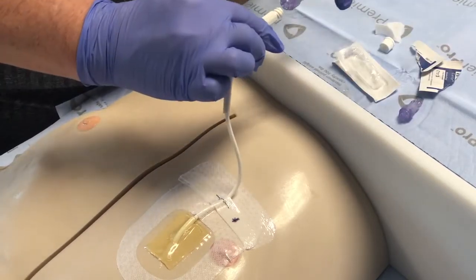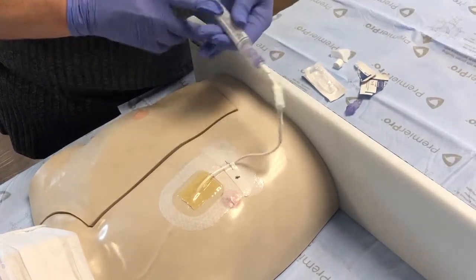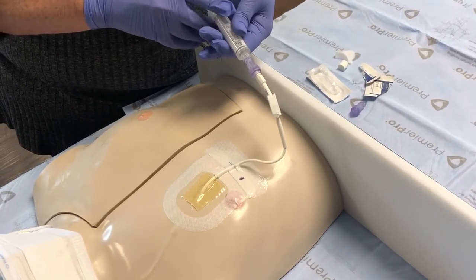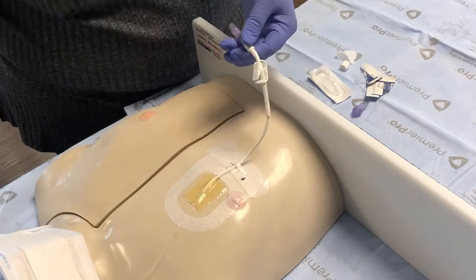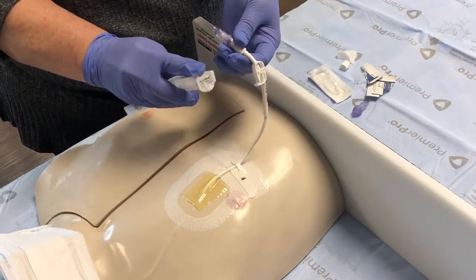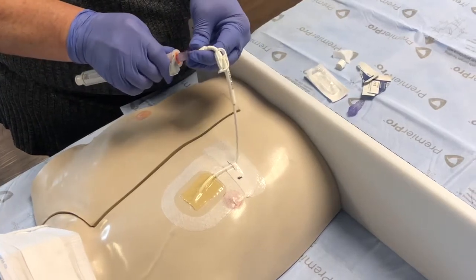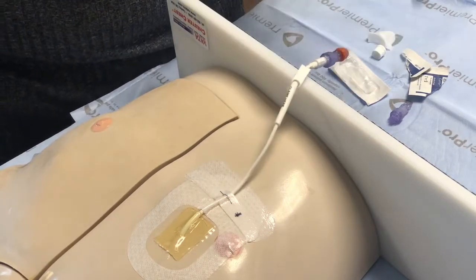Attach the new hub and flush using the pulsatile method. Remove syringe and clamp catheter limb if not in constant use. If your hospital is using swab caps, apply it now. Repeat this process for each limb of the catheter.